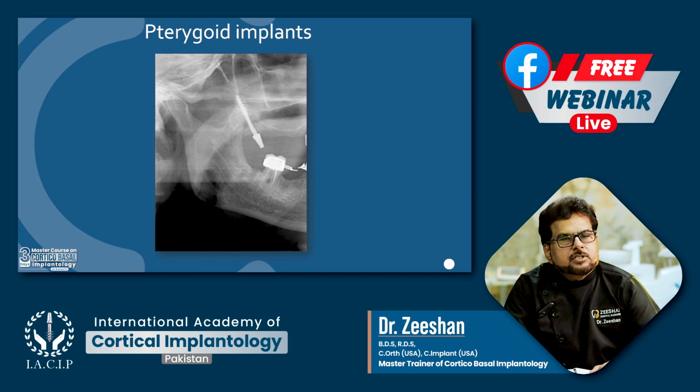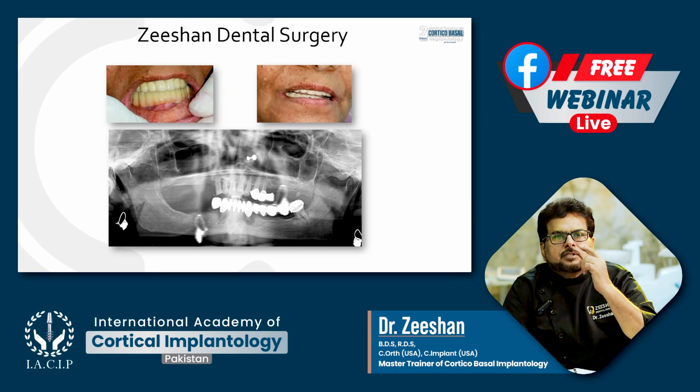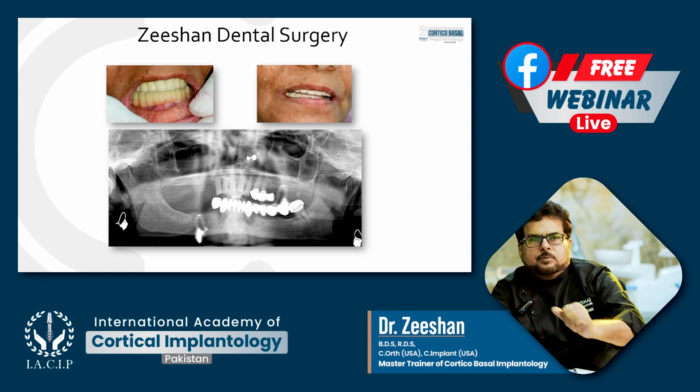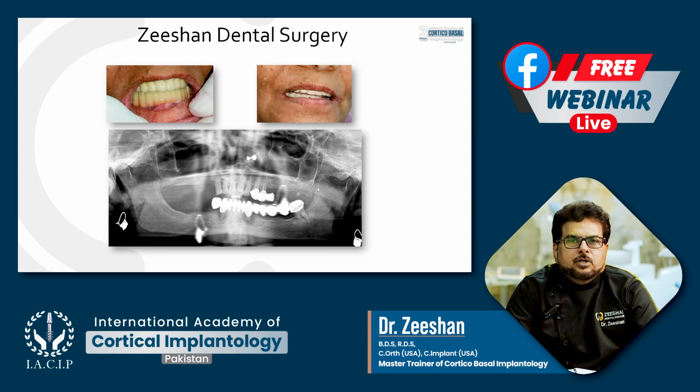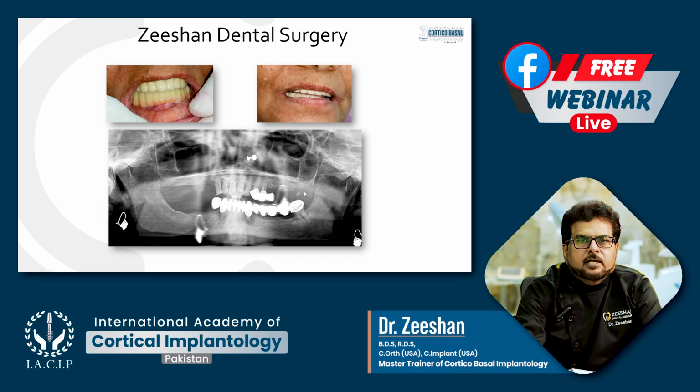Today we are just discussing how to achieve the immediate loading concept and to fulfill patients' needs. See, for example, this is a patient who has a resorbed mandible, resorbed maxilla, and the whole of the upper sinus is lying here at the ridge, on this side as well.